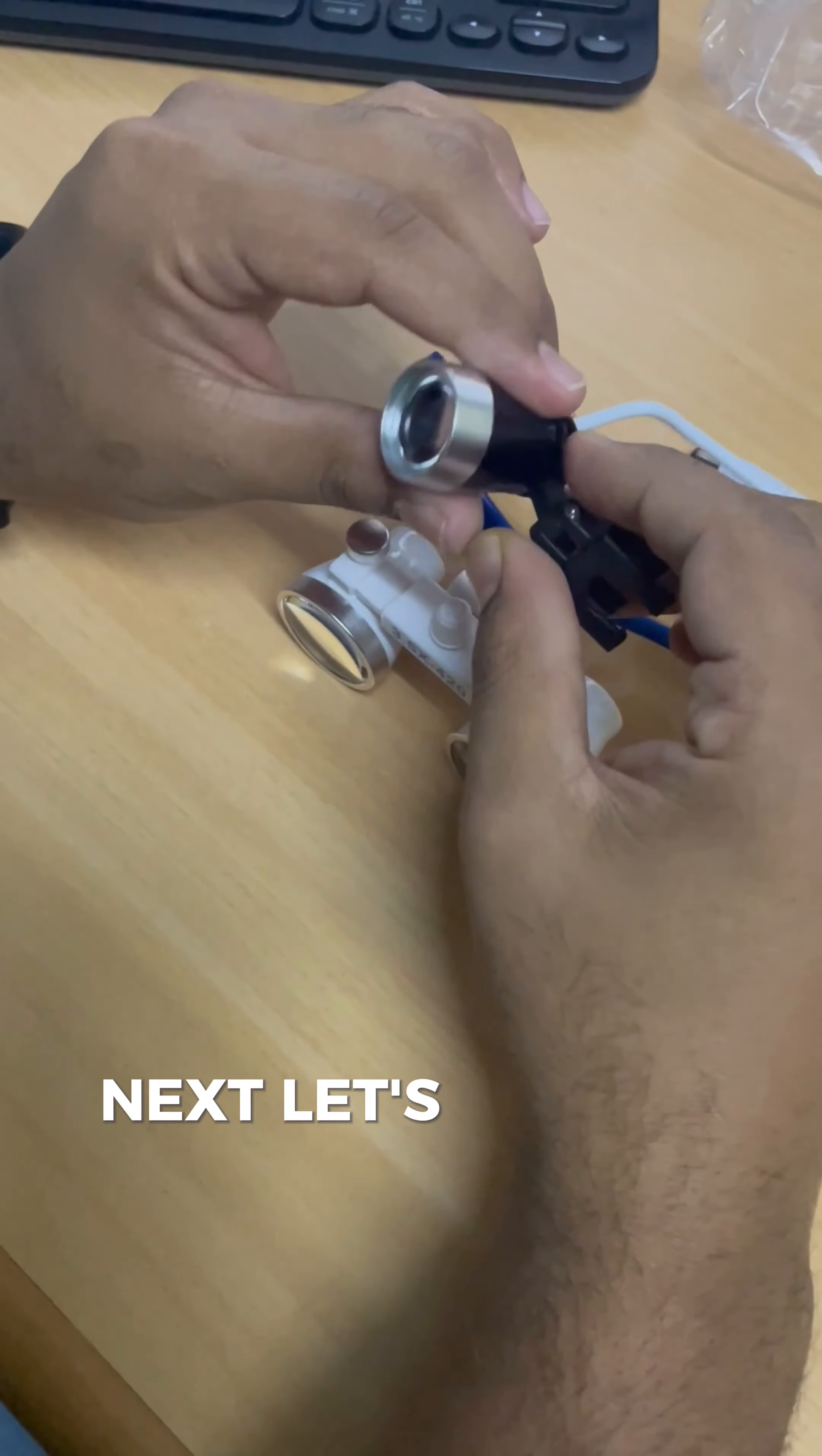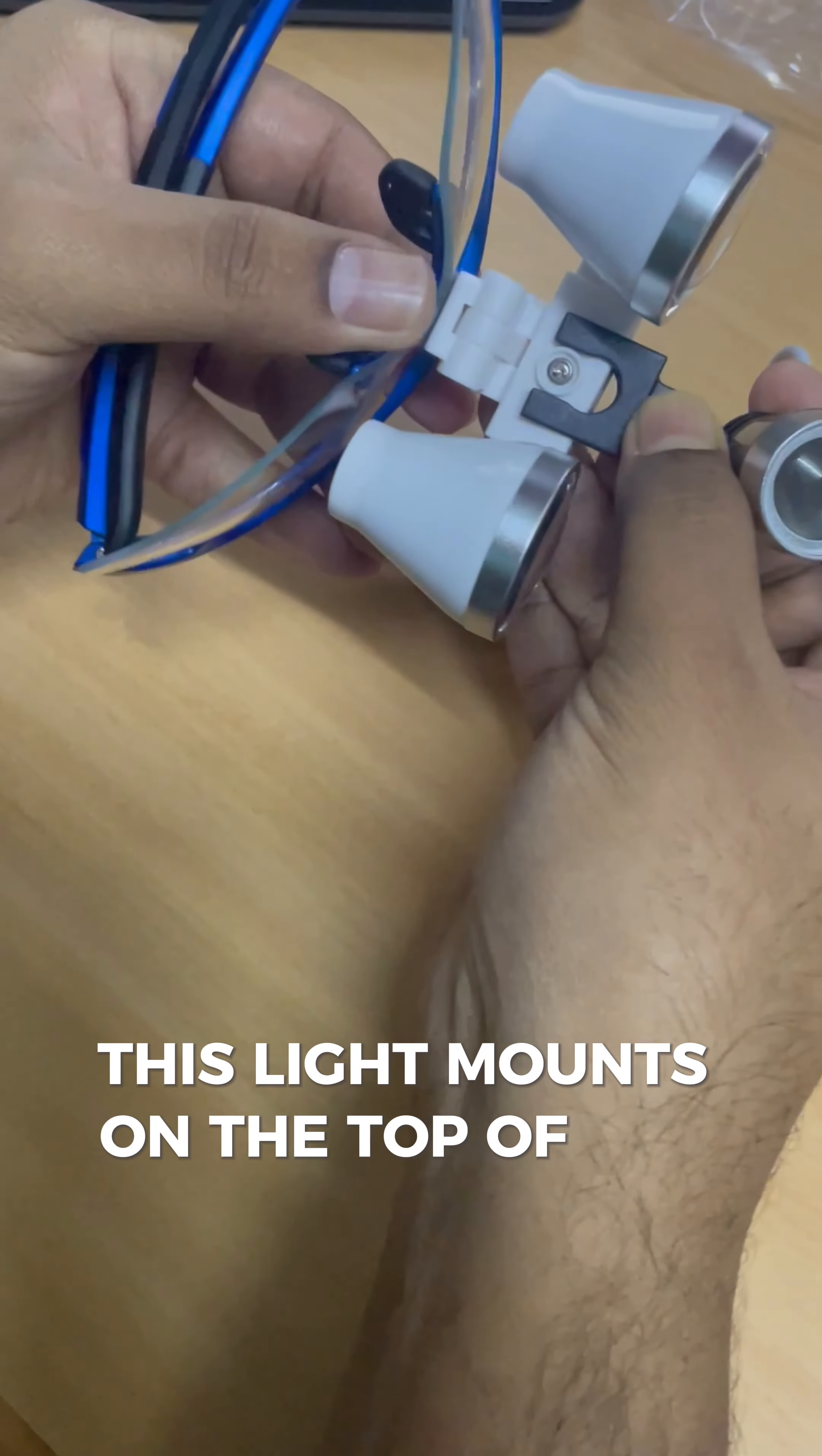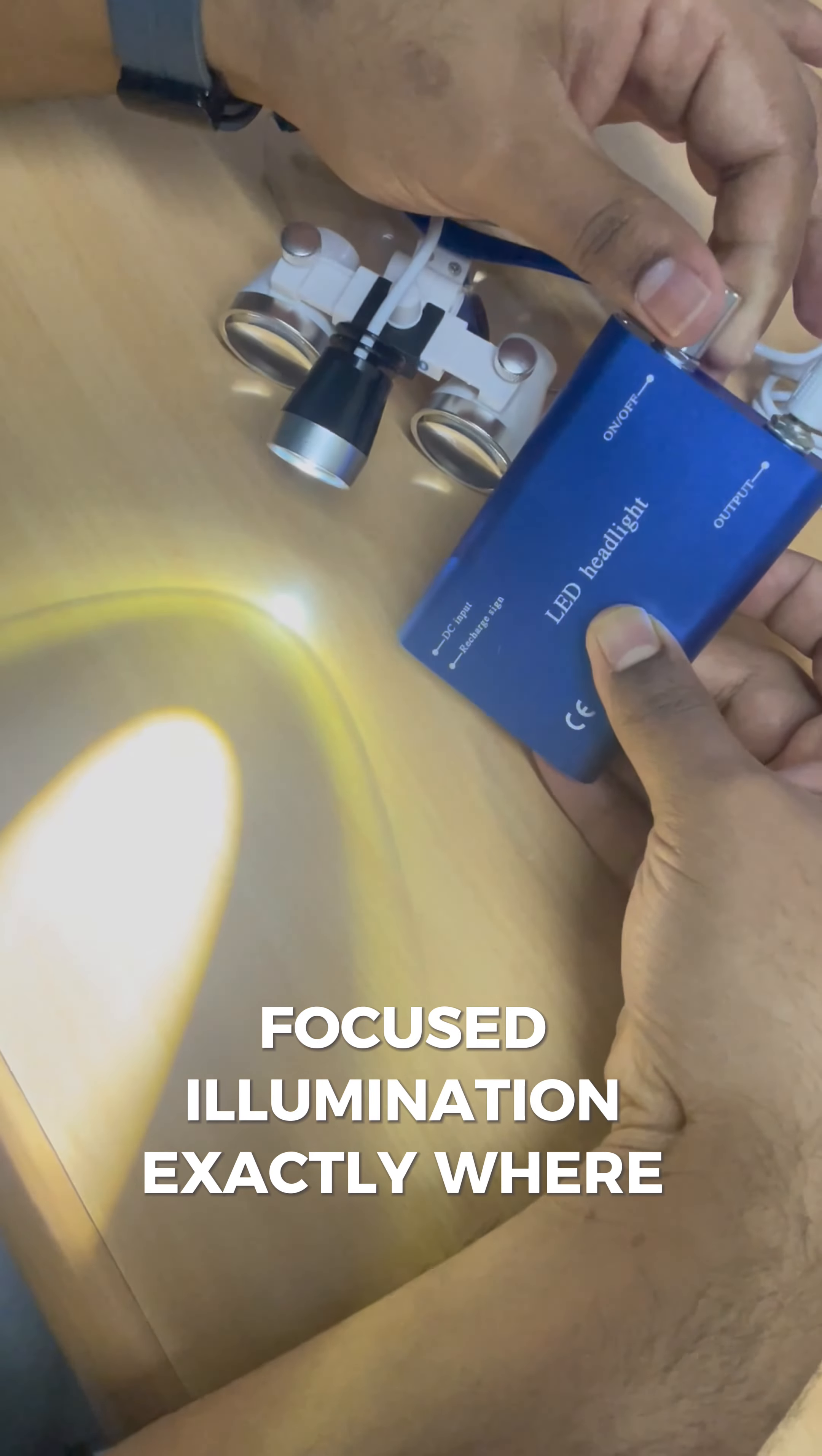Next, let's attach the LED headlight. This light mounts on the top of the loupes, providing clear focused illumination exactly where you need it.